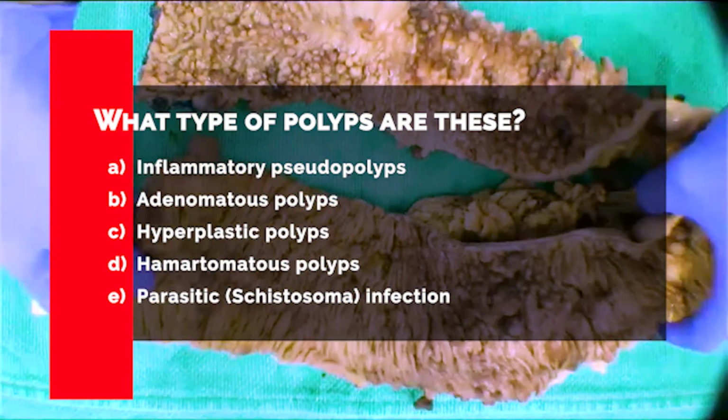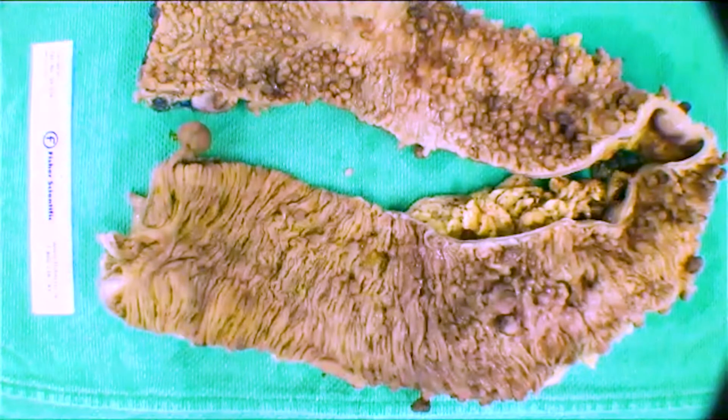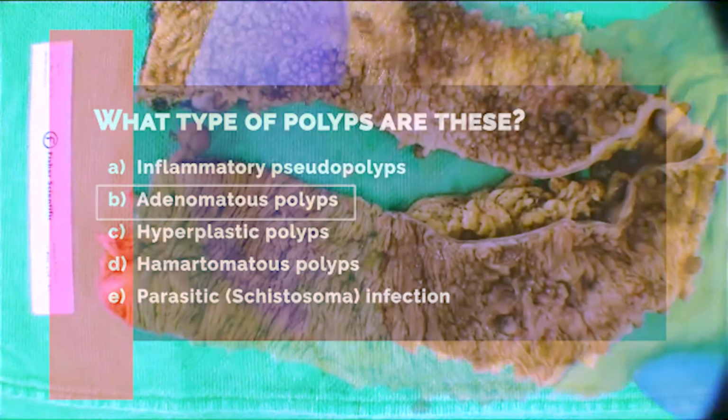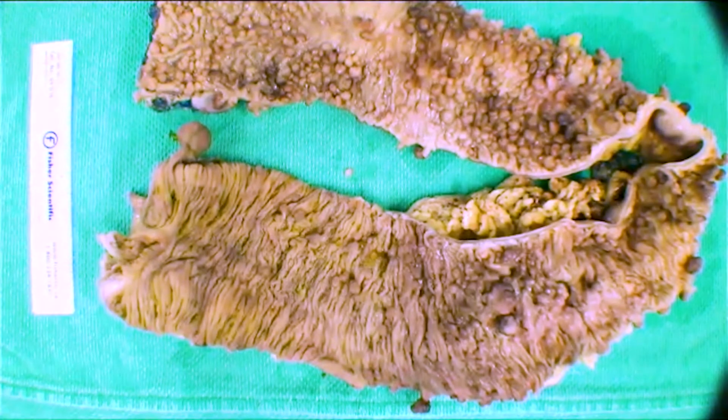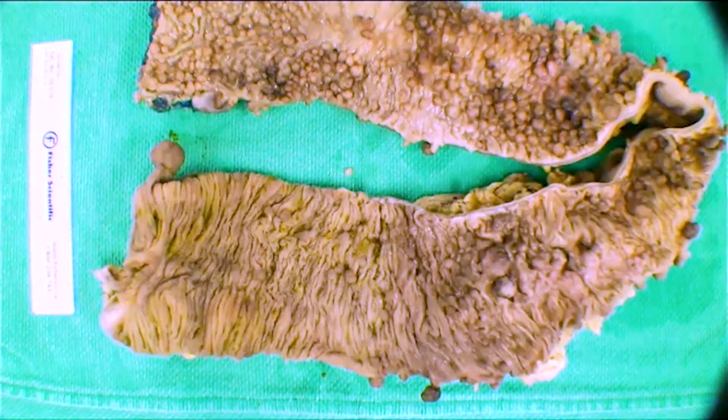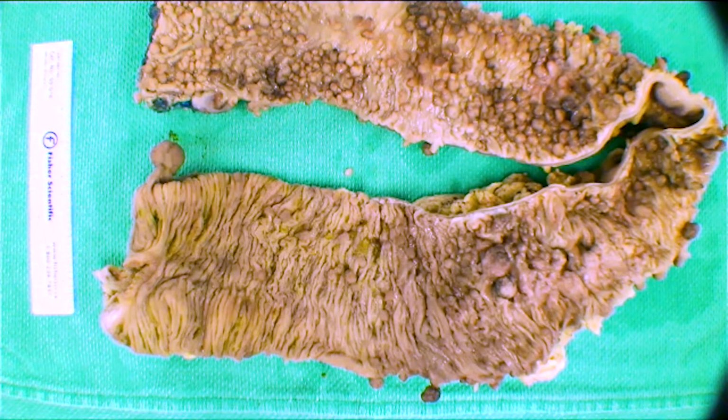There we go. So I think most likely, as people have identified, this is probably an adenomatous polyposis. You can get this degree of inflammatory pseudopolyps, but they're not going to be this well formed. Can someone in the chat tell me when you would see this degree of inflammatory polyposis? Yeah, for sure. Really bad IBD, right? Anyone more favored versus the other IBD? Yeah, absolutely. So with UC, you can get this bad of a polyposis of the inflammatory type.